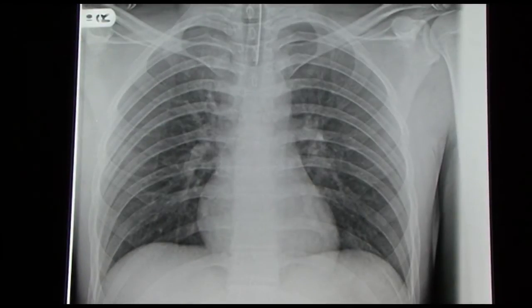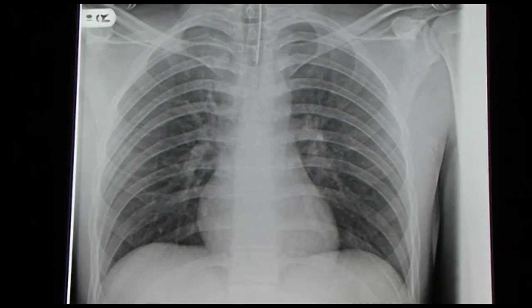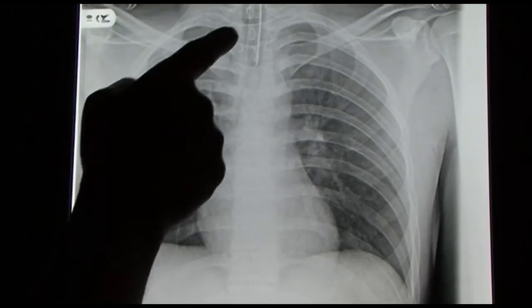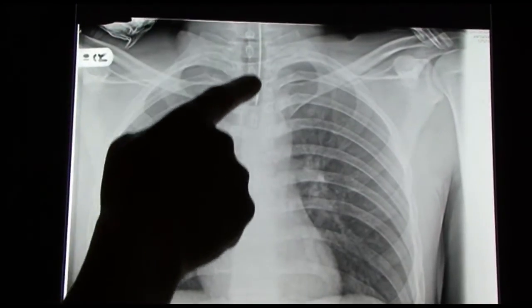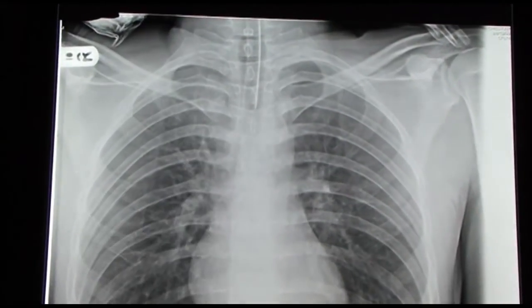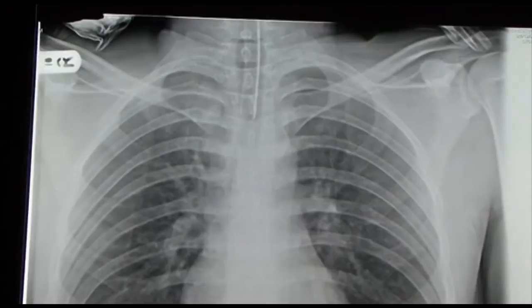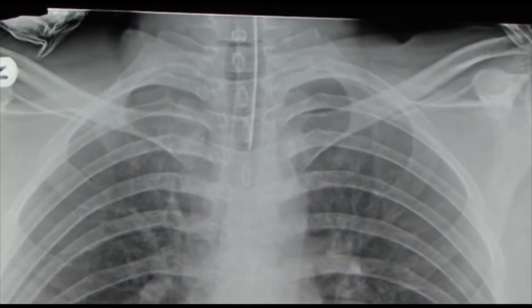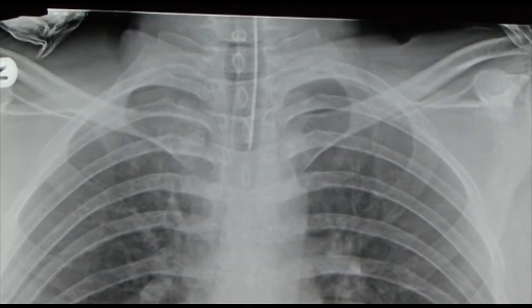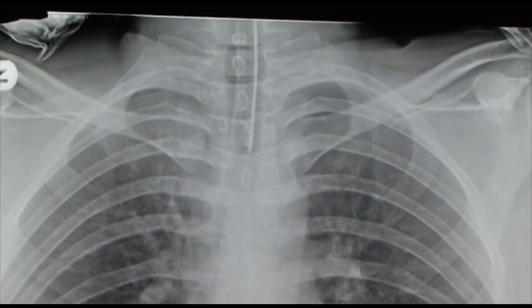Here we're looking at a basically normal chest X-ray. There's only one thing wrong with this: there's an endotracheal tube in the patient's trachea, so this patient is actually intubated. But apart from this, we're looking at a normal chest X-ray.